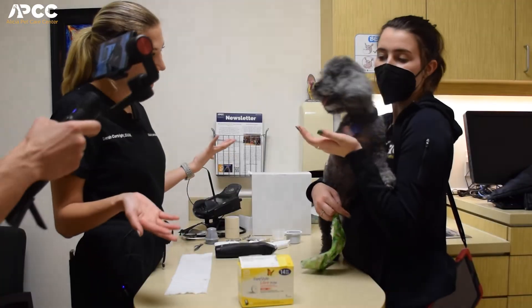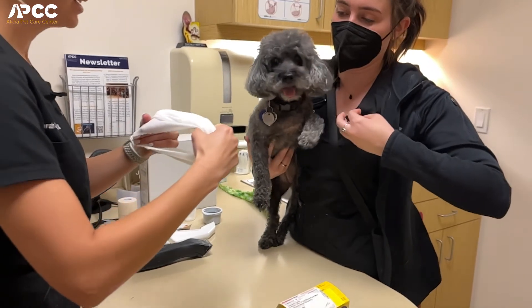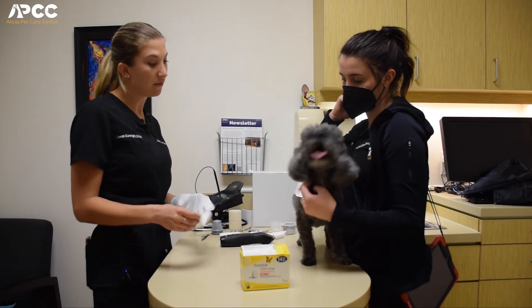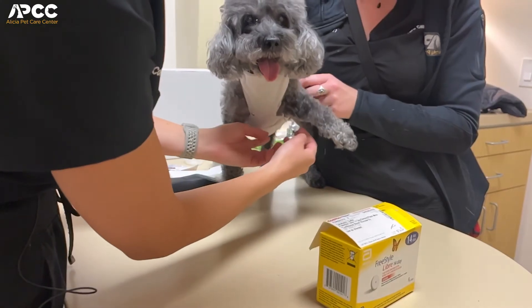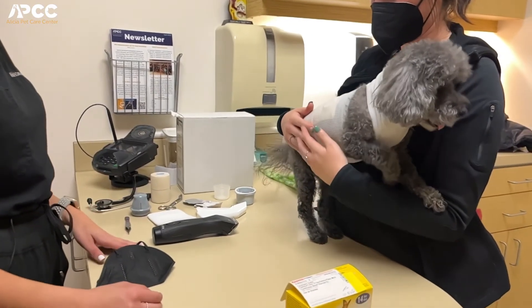You look beautiful! And then we're just going to put this on top of you to protect the sensor one more layer. The biggest issue that we see with the sensors is if they scratch them off, but since we've been putting the tape on top and then this little t-shirt we really haven't had any issues, and they've been keeping them on for a majority of the 14 days or so.